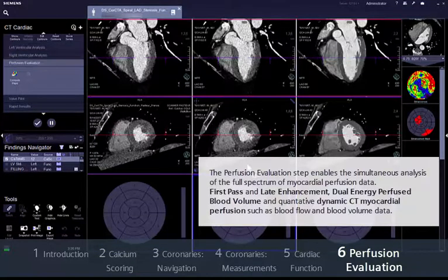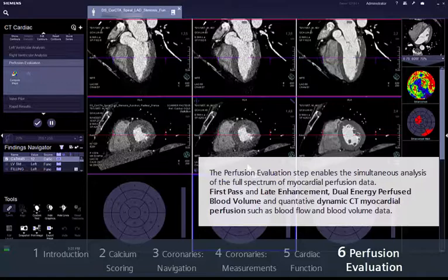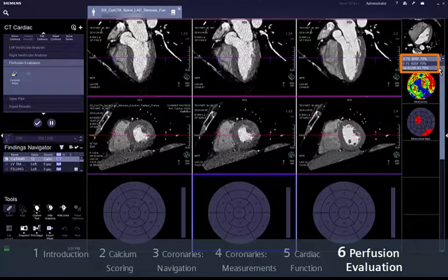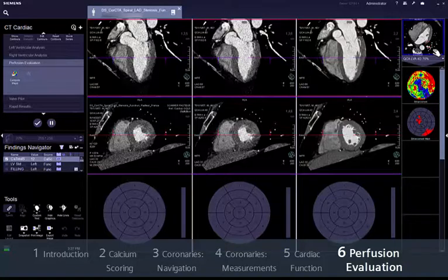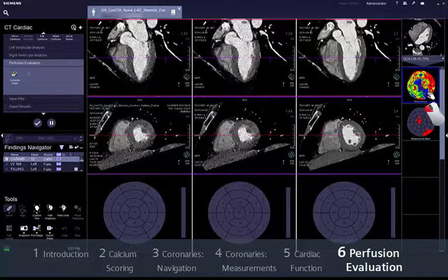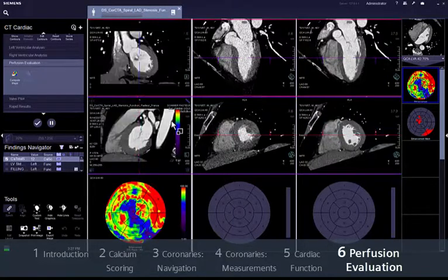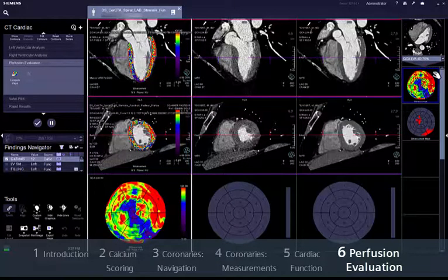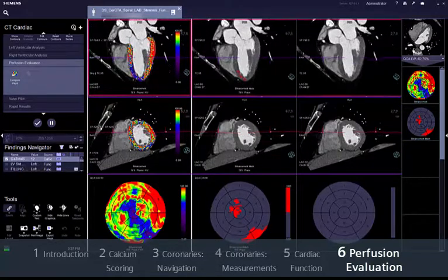The perfusion evaluation step enables the simultaneous analysis of the full spectrum of myocardial perfusion data. This includes first pass and late enhancement, dual energy perfused blood volume, and quantitative dynamic CT myocardial perfusion data such as blood flow and blood volume data. All existing series are available in the drop-down list in the result gallery. To compare different evaluations — for example stress and rest, or first pass enhancement, dynamic perfusion and late enhancement — just select one of them. The anatomic image will appear as a thumbnail and all available results will be displayed in the result gallery as polar maps. Drag the corresponding result to one of the three columns of the layout and proceed in the same way to compare other evaluations. The polar map visualisation and the direct overlay in short axis and long axis views help pinpoint the perfusion defect.